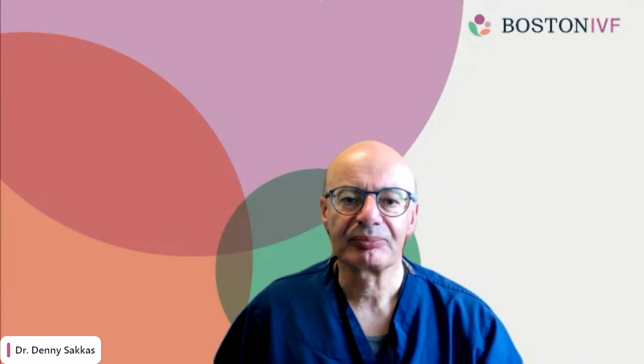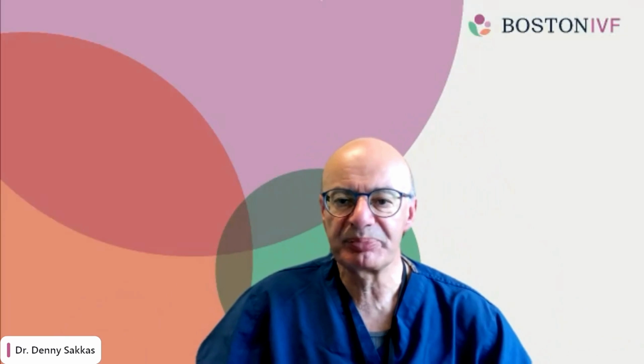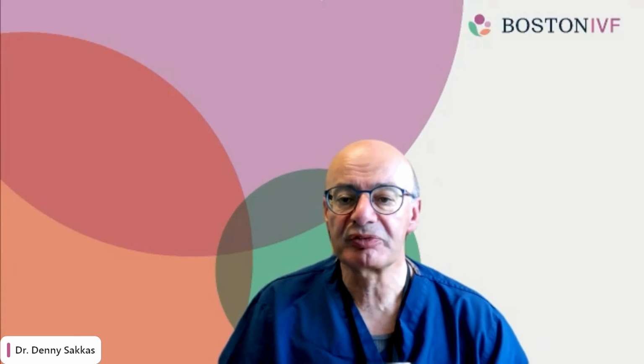Yes, thank you. The next question has to do with egg freezing versus embryo freezing, the differences in the labs for doing those, and maybe a little bit about the success rates. As I said, vitrification has really revolutionized the way we approach freezing. For both egg freezing and embryo freezing, what we put in, we expect at about 95% to get out. Our success rates at warming embryos are well over 95%. For an egg, we expect 95% of them to survive. For a blastocyst, we expect about 98% of them to survive.